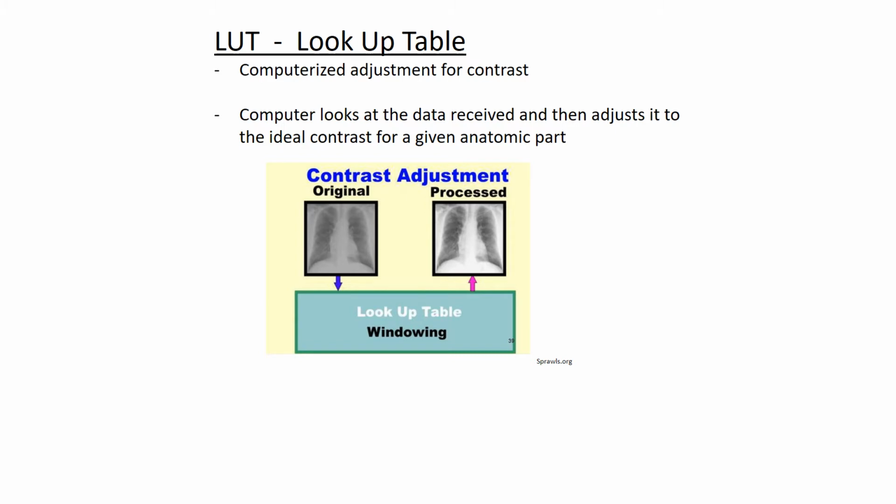So once the computer looks at that, then it's going to utilize another method that's really the one that's more involved with the contrast, and that's called your lookup table. Your acquired histogram was looked at by the computer in relation to the reference histogram, and it's going to merge them. It's going to try and make whatever histogram you took into what would be the ideal histogram.